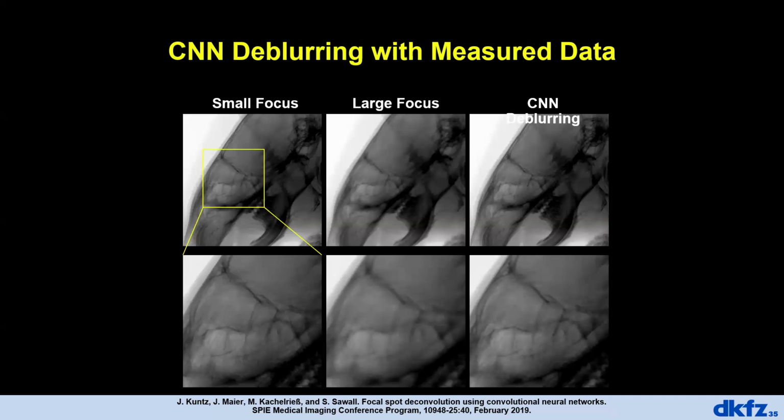basically correcting for metal artifacts usually means coming up with new data to complement your sinogram. Because in case of metal artifacts, your sinogram is missing some data due to photon starvation and effects like that. And what these networks need to do is to come up with reasonable data to fill these gaps in your sinogram. And from what we already saw in other publications, they are quite good at doing so.